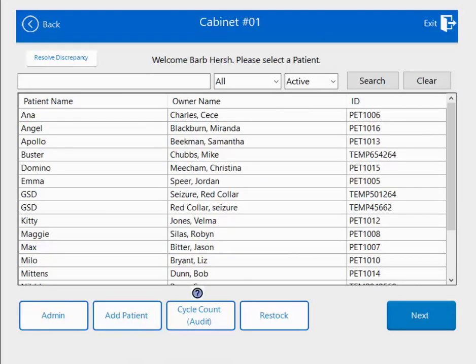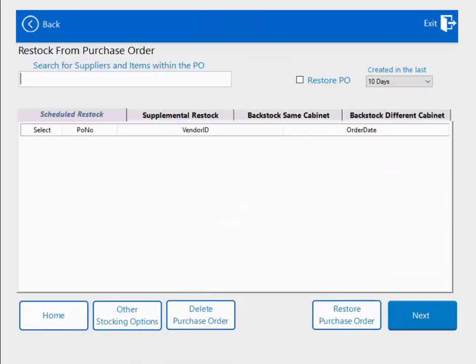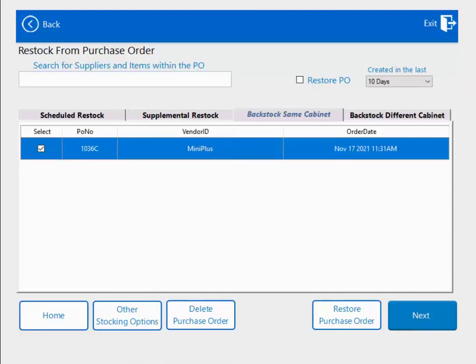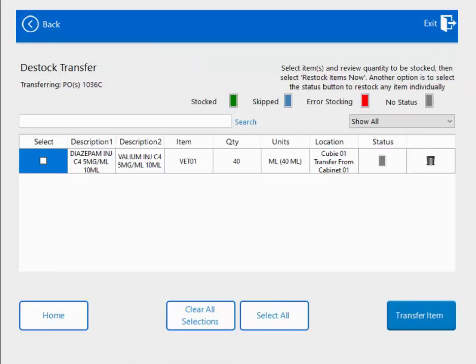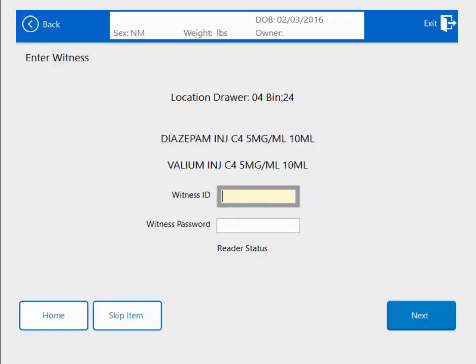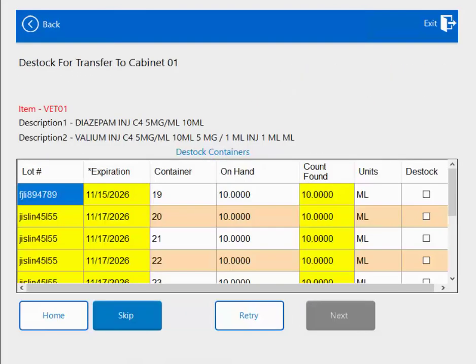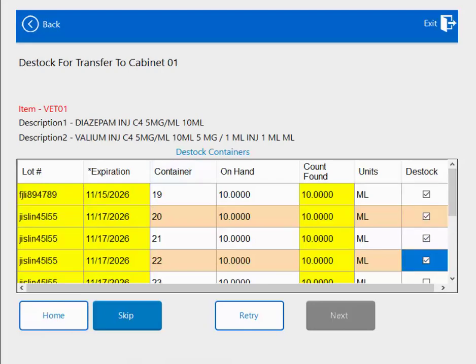Now let's take a look at a backstock restock. I'm going to click on the restock button and select backstock same cabinet. I have a purchase order sitting here, which means I need to replenish some active stock from my backstock. I select it, hit next, and it takes me to the purchase order screen to show how much I need to replenish. I select it and hit transfer item. Because this is a controlled substance, I have witness turned on for restocking. I'm taken to my backstock drawer and will be replenishing 40 mils, or four bottles. I check the next four containers in sequence.